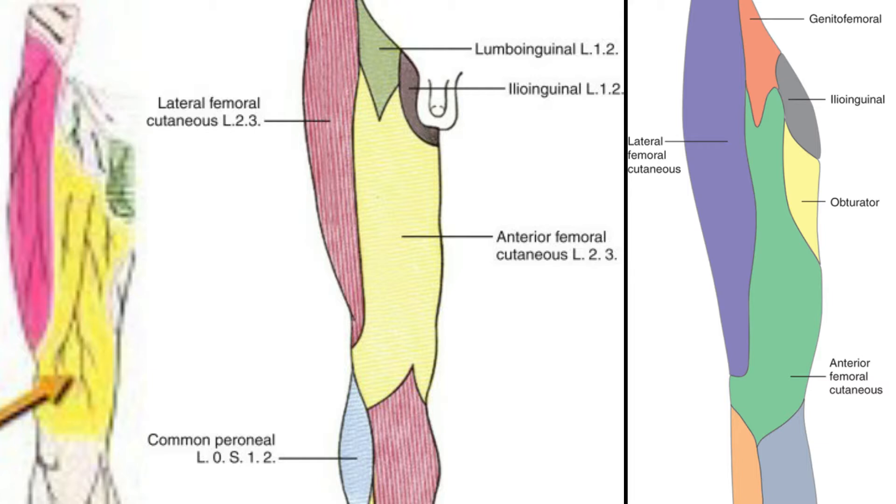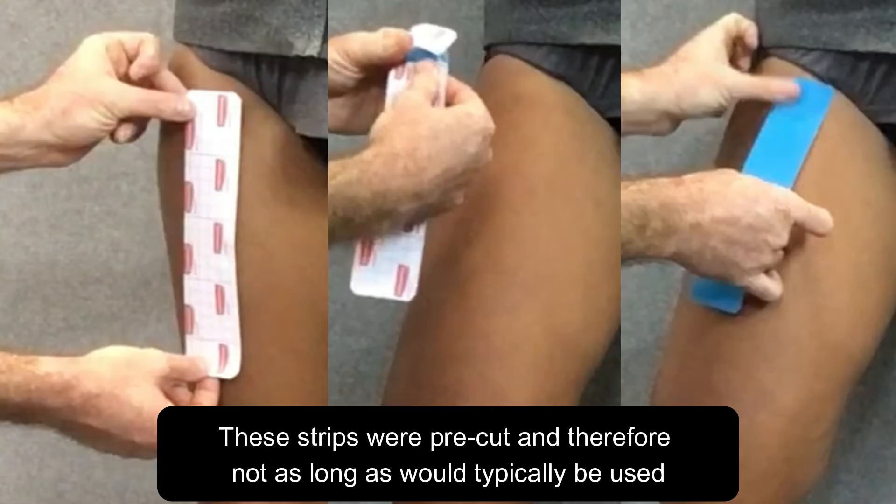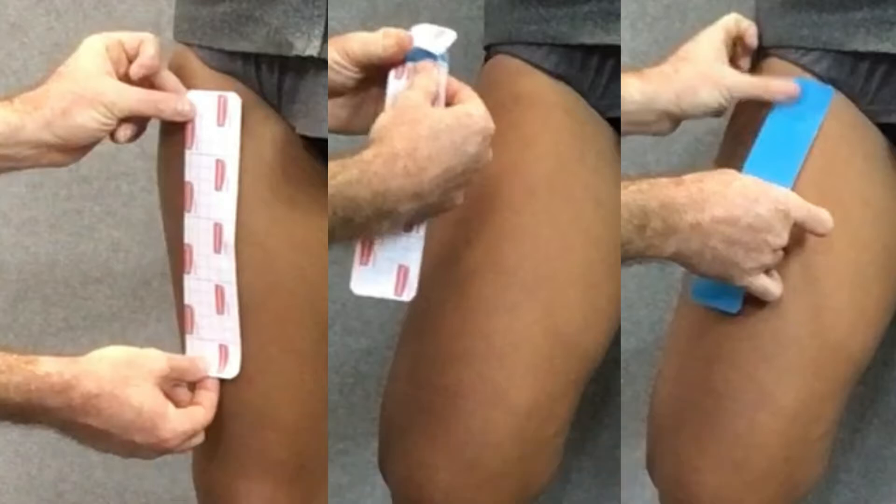We're going to measure and cut three I strips from the upper thigh to about five centimeters above the knee, as they will end before the actual knee joint. We want the person to bend the knee and place the front of the thigh on stretch.